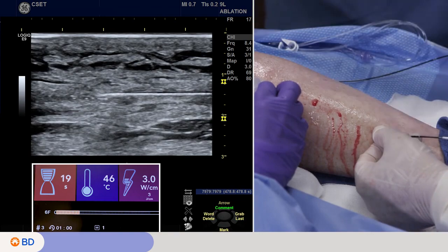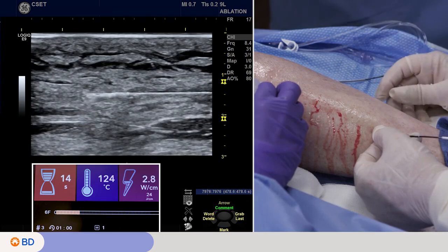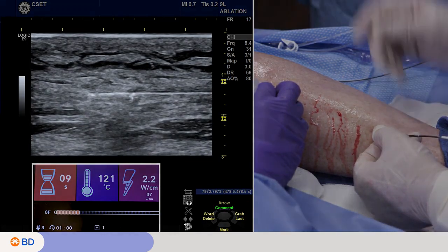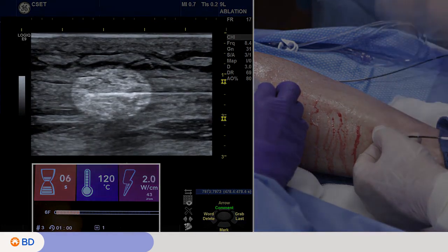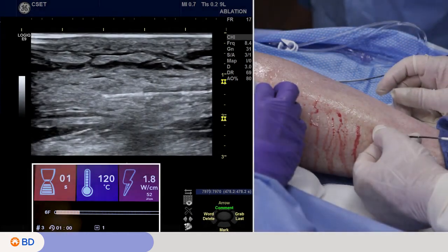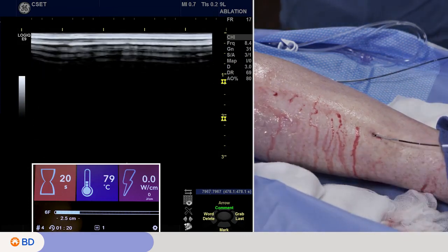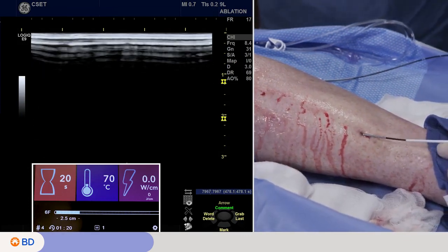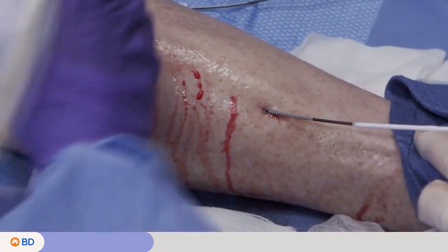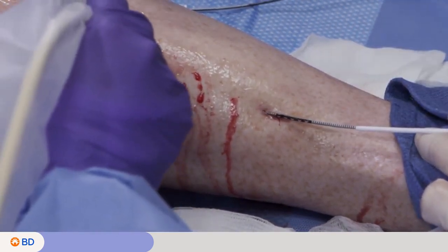It will still deliver the 20-second treatment, but you can hear the pitch from the generator is at a higher level. And we can also see on ultrasound the 2.5 centimeter treatment length right at the distal tip of the catheter. So the decision to be made now is if we're done or we want to do one more. I'm anchoring this again so I have a landmark so I know exactly how much I'm pulling back, and I'm going to pull back one more 2.5 centimeters right to there.